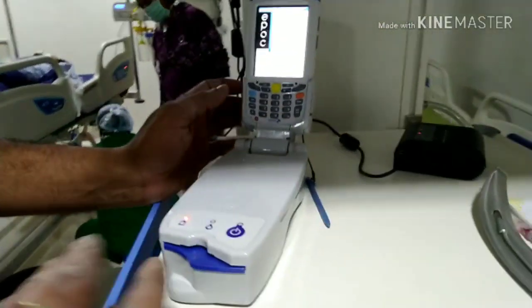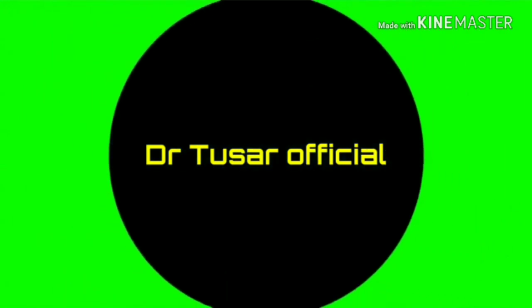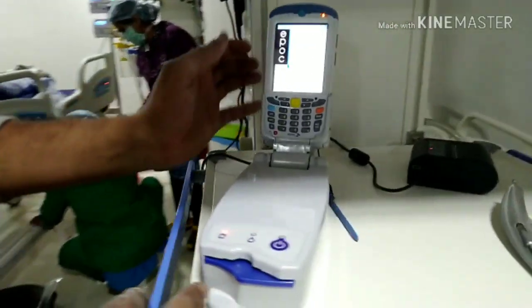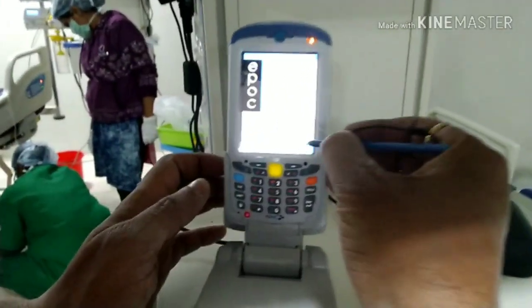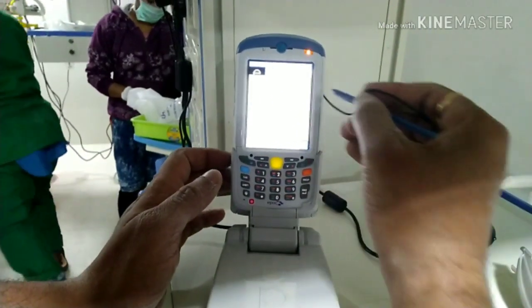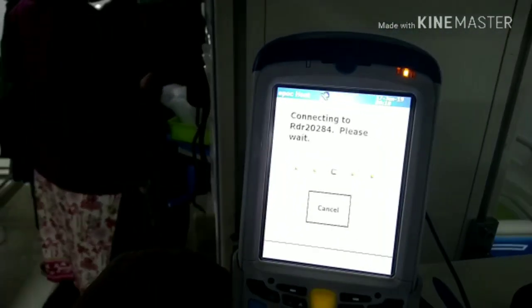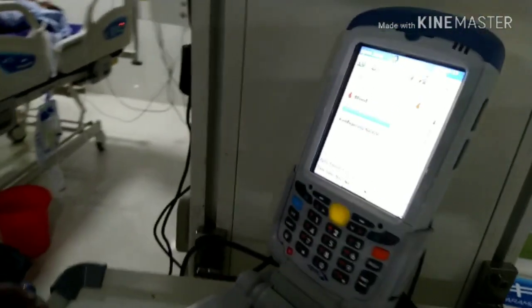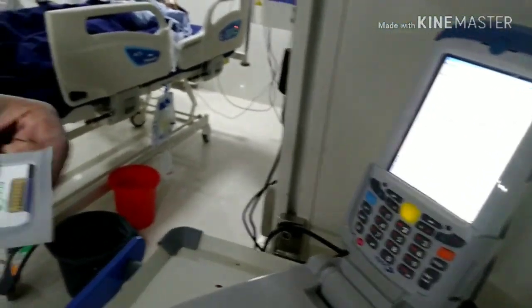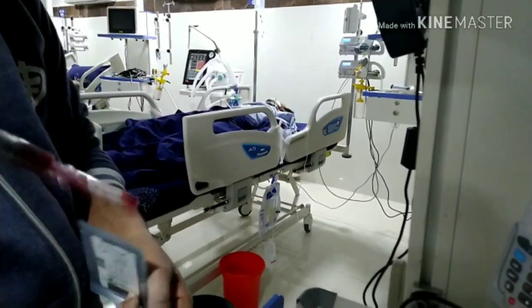Do you know what this is? This is the smallest ABG machine. First, login with your user ID and password and wait for calibration. Once it is calibrated, please wait for the instructions. Prepare the blood sample and the card.